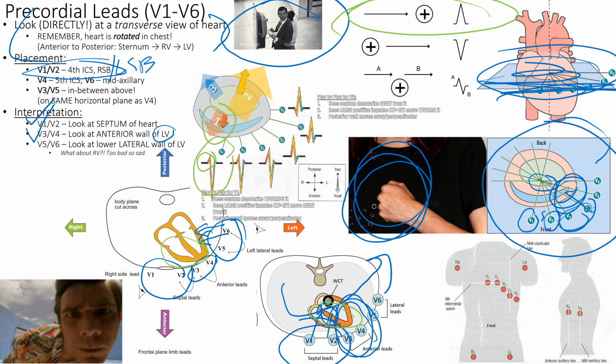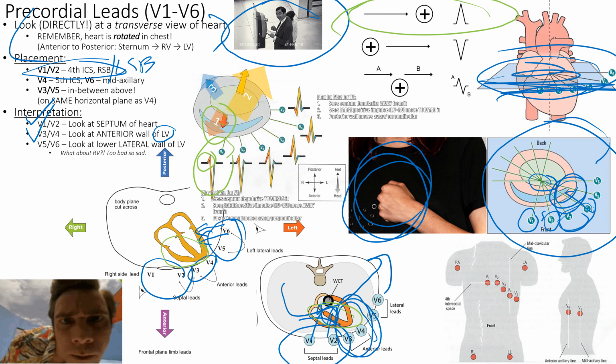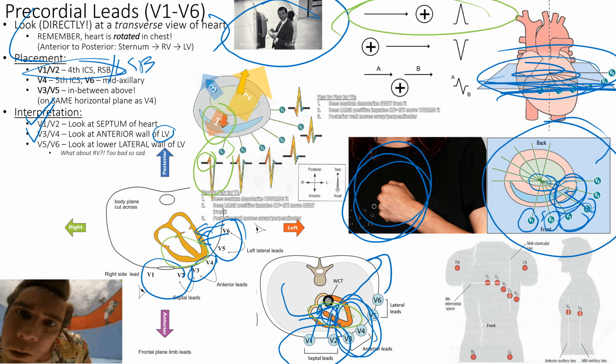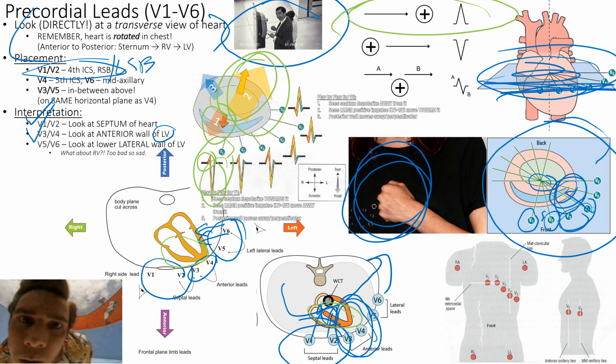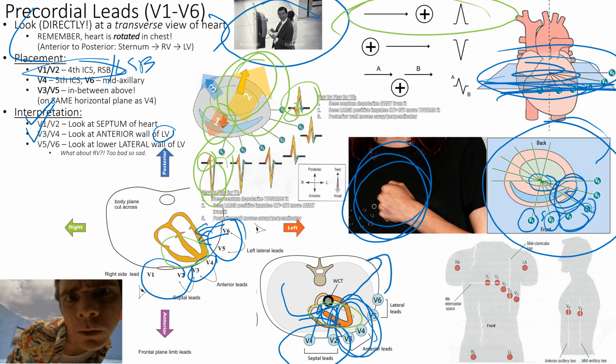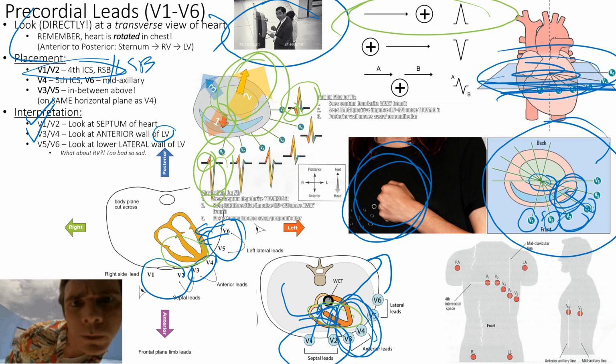And then what happens next is the ventricles get depolarized. They depolarize simultaneously. And which is the bigger ventricle, left or right? Left. We look at vectors in physics: when you add a big vector and another vector going away from it, the big vector is going to win, right? So we have this huge big one happen afterwards. That's the second episode that happens. So obviously my V1 right here, it went away from it. That's negative, whereas in V6, definitely positive. And why is it negative initially? Because it went away from it. V6 is sitting over there. First step, septum got depolarized, went away from it. Second step, this huge impulse going towards me. Okay, so that's the precordial leads and how they operate.